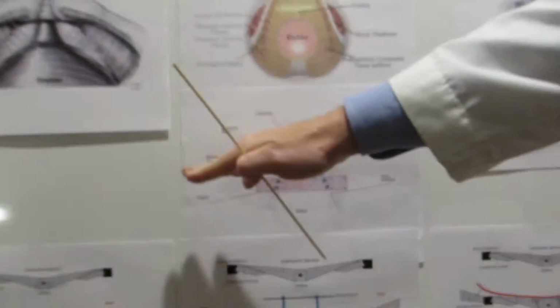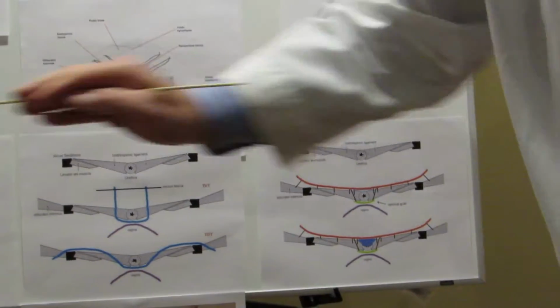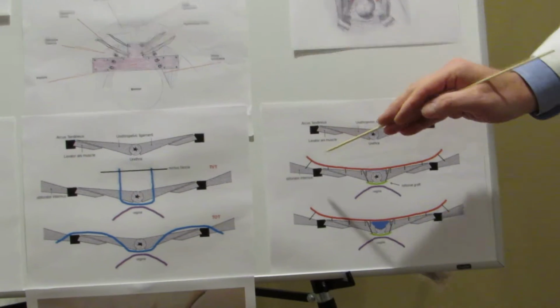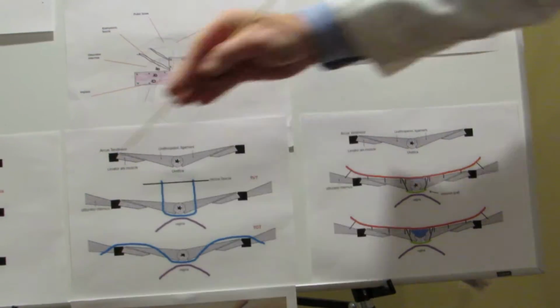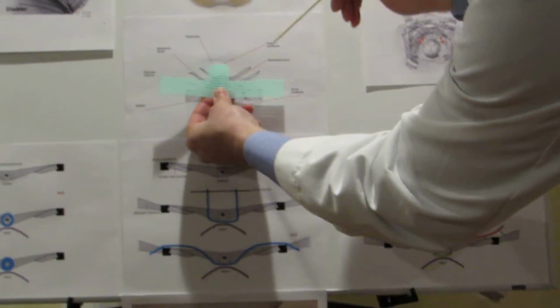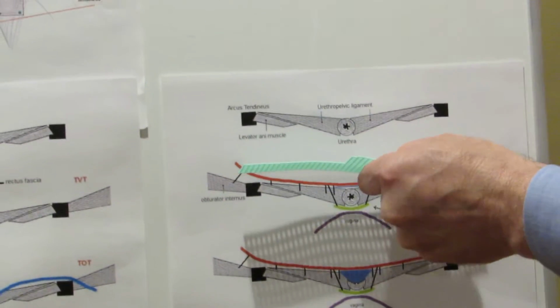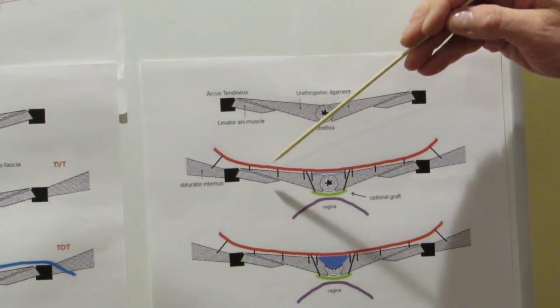So a cross section of this would be this. This again is our cross section, just as we see in these other areas: urethra, urethropelvic ligament, and the obturator internus is way out here, and that's in this picture right here. And basically you would lay this here, placing tacking points to keep all this in place, and such as here. These, what all these little things are here, this would lay here like this, and you would tack it down with little needles and sutures.